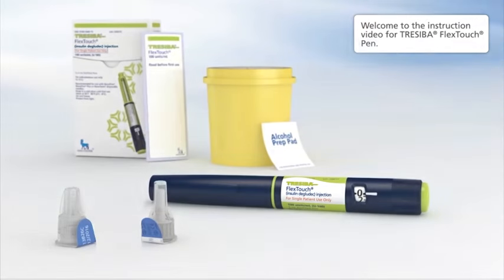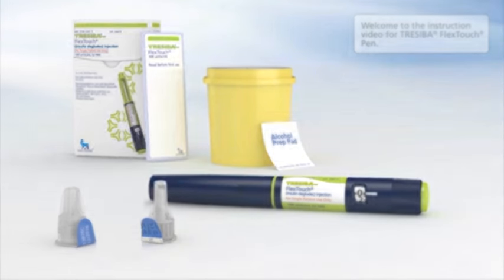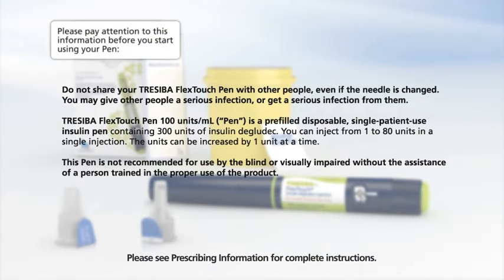Welcome to the instruction video for Traceeba FlexTouch Pen. Please pay attention to this information before you start using your pen. Do not share your Traceeba FlexTouch Pen with other people. Even if the needle is changed, you may give other people a serious infection or get a serious infection from them.